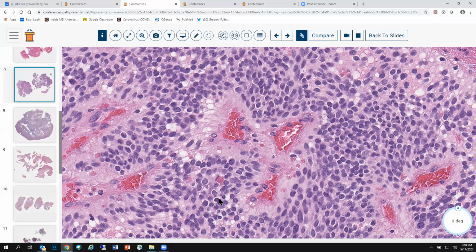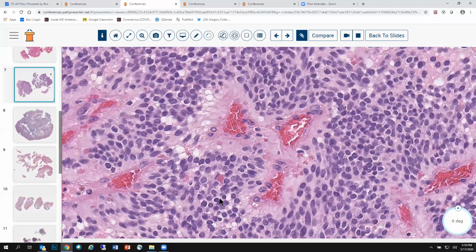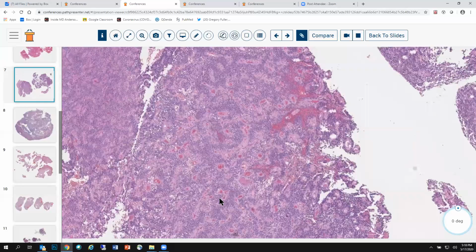A rosette-forming glioneuronal tumor has perivascular pseudorosettes. All right, now they are synaptophysin positive, not GFAP, but that's just one example. Papillary meningioma has perivascular pseudorosettes. The endocrinoid perivascular rosettes of pituitary adenoma can mimic ependymoma if you didn't know better. That's a really nice unknown to give. But this tumor is screaming ependymoma.